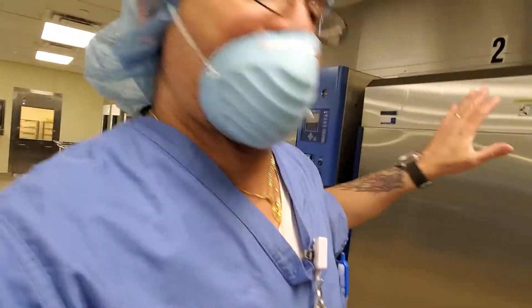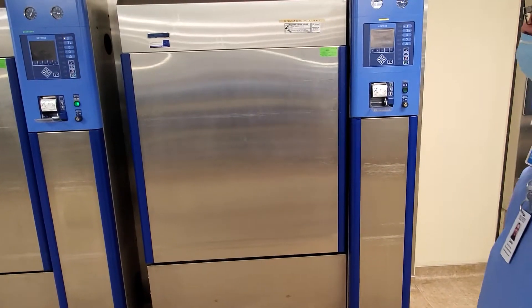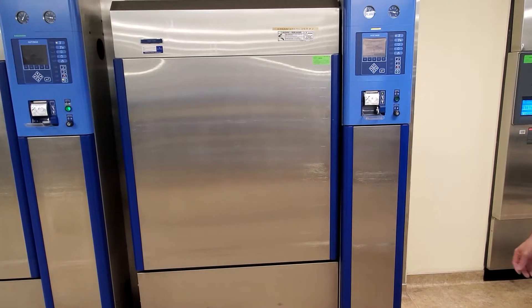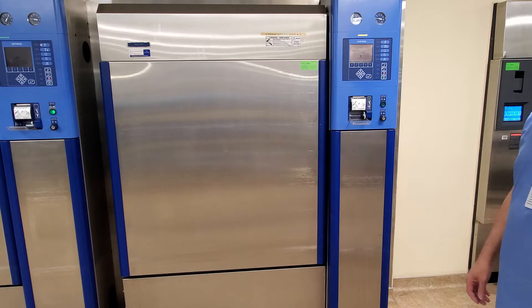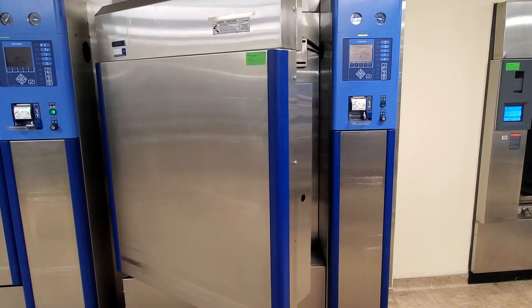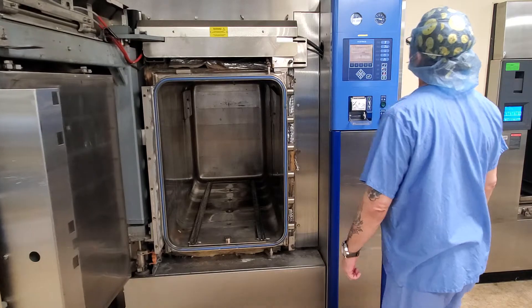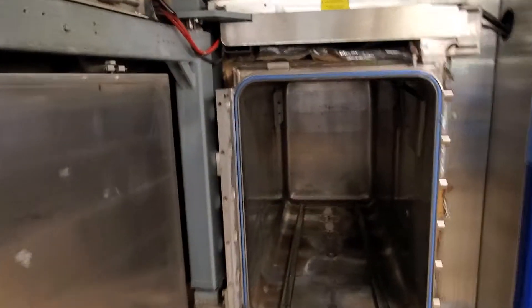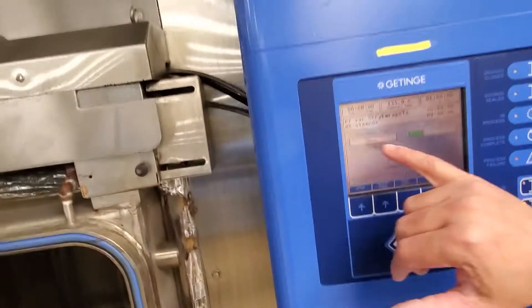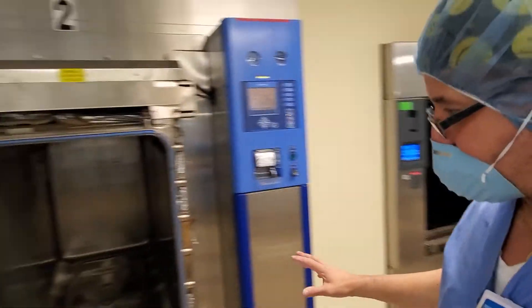This is the machine — the sterilizer, or the chamber for the sterilizer. We're going to open it up and see inside. The tray is going to go in the chamber. This has a special cycle time and a special temperature: 135 degrees Celsius, dry time one hour. This is the regular standard.